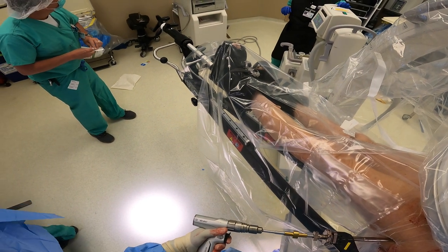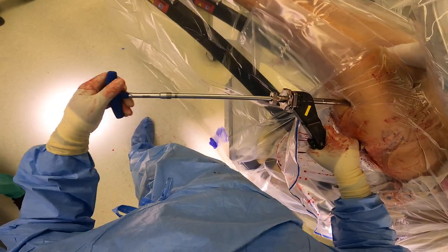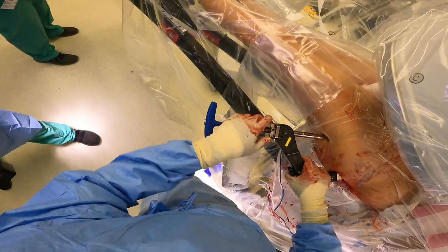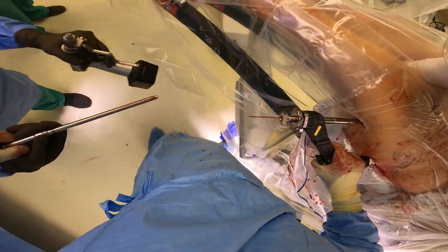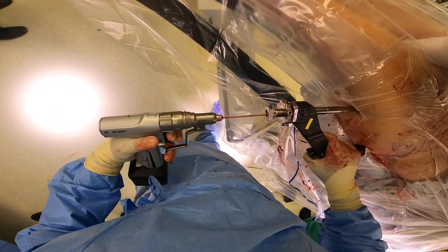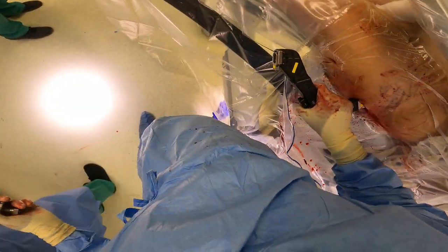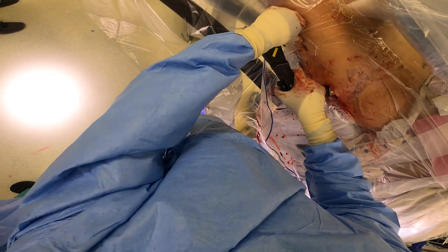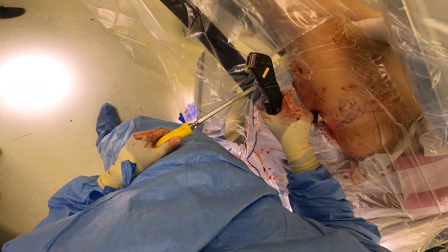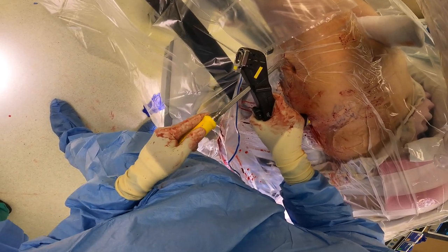We're going to drill to create a path across that femoral neck. Then we'll place a screw — that screw will go through the skin and then through the bone and then inside of the nail to stabilize it. This is a lag screw; it goes across the femoral neck to provide some anti-rotation forces for the proximal part of the femur. We're going to remove this pin and apparatus, and then place one more additional screw — a distal locking screw — just to lock the screw and hold it in place inside the bone.